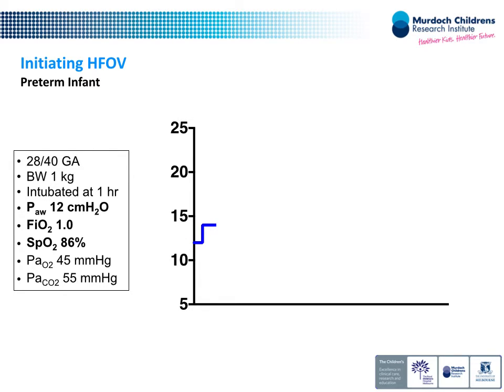I'm going to show an approach that is what we've been doing, an approach that Anton has been doing for longer than us, which is pre-surfactant. Maybe at the end, hopefully, we'll have time to discuss the rationales of each, and there is a group in Europe that will do it differently. They would give surfactant now, or at least if they're on the oscillator before they do recruitment, they would give surfactant. But I'm going to show you the approach of going to the oscillator, doing recruitment, then giving surfactant, and showing the effect you can get from recruitment that's non-surfactant related. I guess that's why monitoring is so important. Yeah, how this can change with direct monitoring.